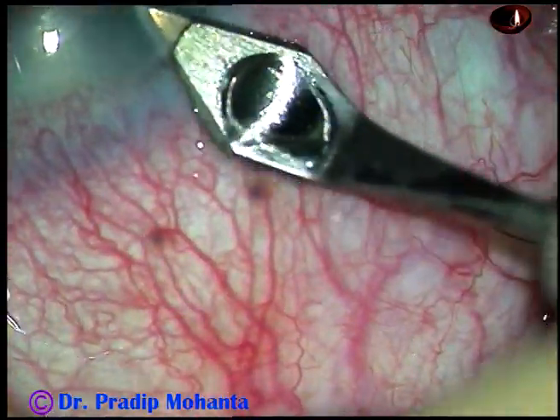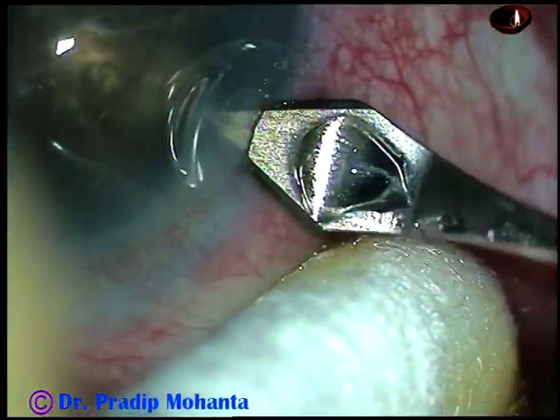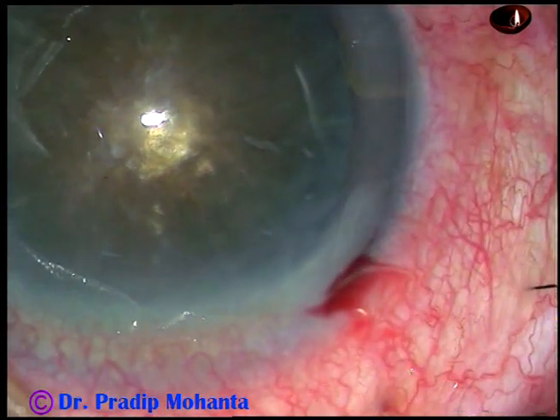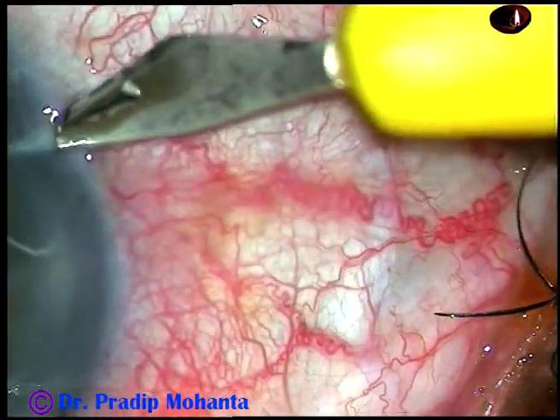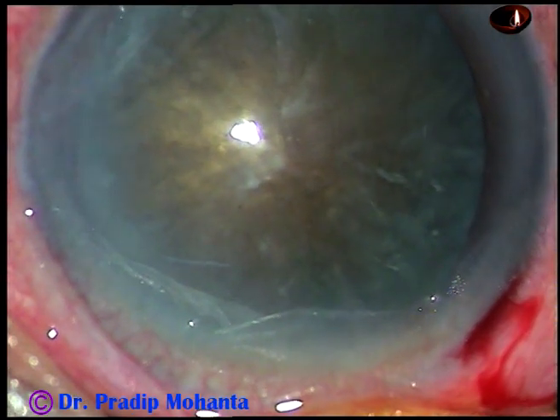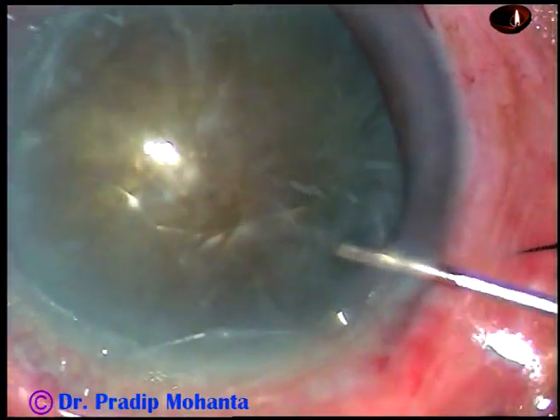This is the main incision on the posterior aspect of the limbus with a 2.8 millimeter keratome. We can see oozing of blood from the main incision. Now one side port has been made on the right side.